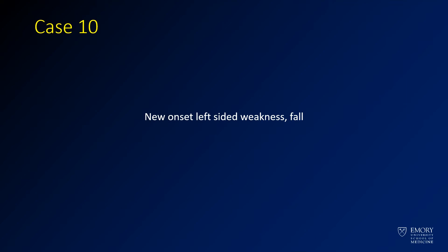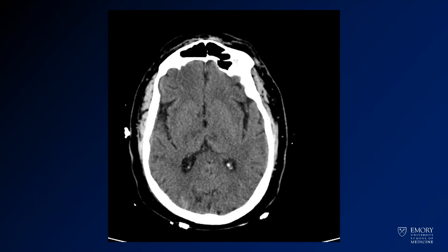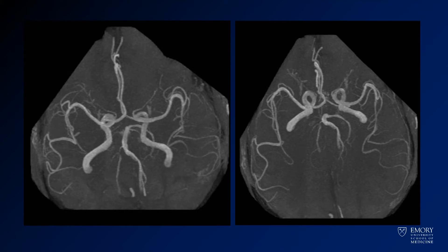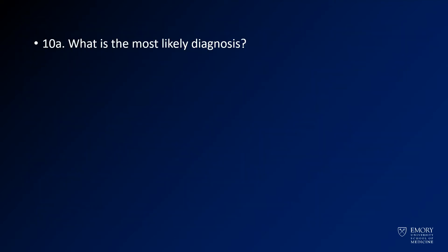For case 10, we have a patient with new onset left-sided weakness on fall. Here you see a CT image through the level of the thalamus. You have an axial FLAIR and an axial diffusion-weighted image through the same region. These are some projection images from an MRA performed at the same time as the MRI. The question is: what is the most likely diagnosis?